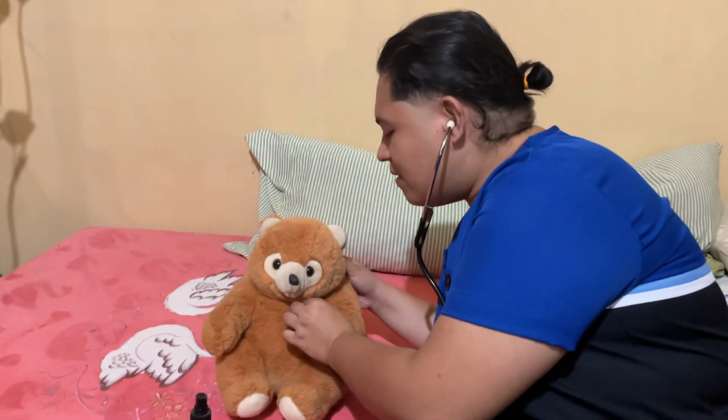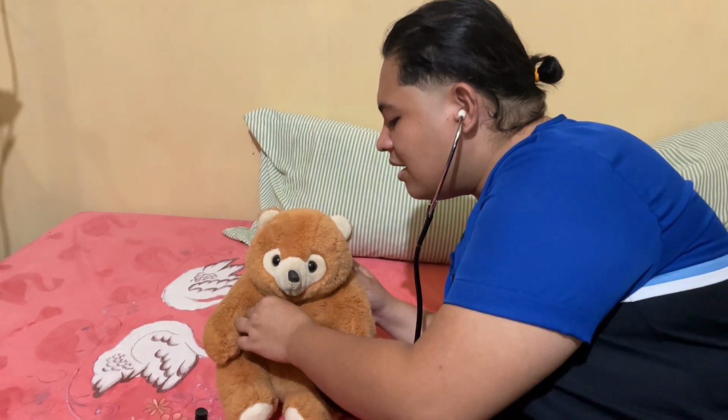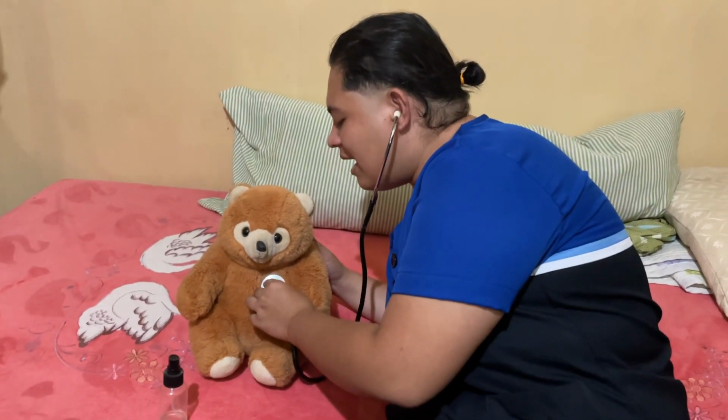Assess the patient, auscultate the chest, measure the heart rate and respiratory rate, and measure the peak expiratory flow as indicated, and obtain the baseline data of normal breath sounds or findings. So, I will auscultate your chest, sir. Inhale. Exhale. Inhale. Exhale. So, basically normal, no wheezing and crackles.